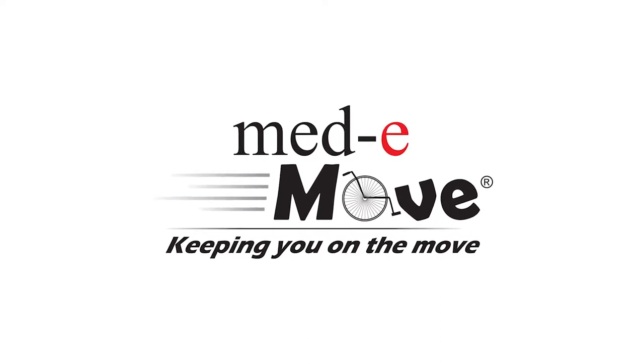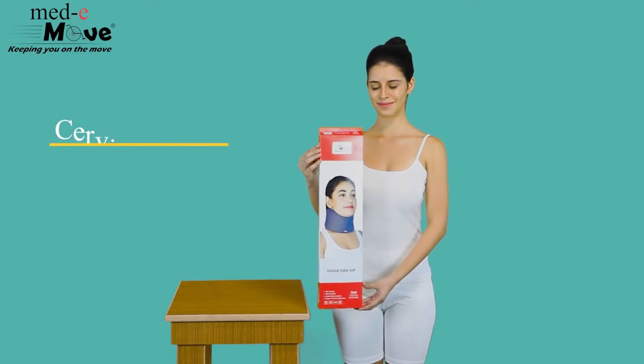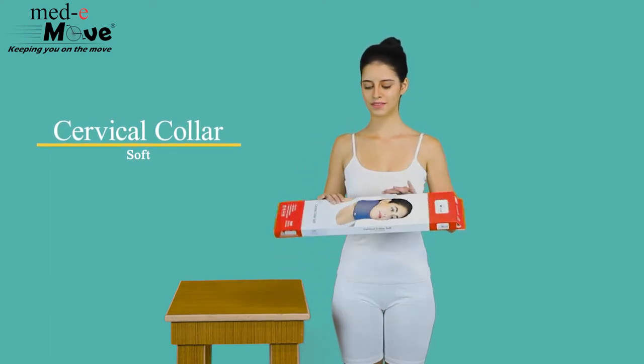Medimove. Keeping you on the move. Here we will demonstrate how to measure the size and wear the Medimove Cervical Collar Soft.